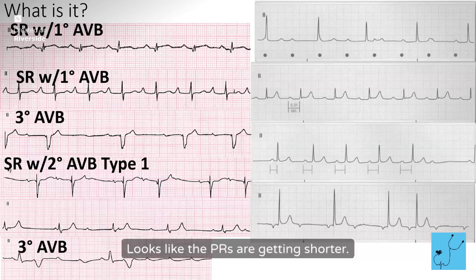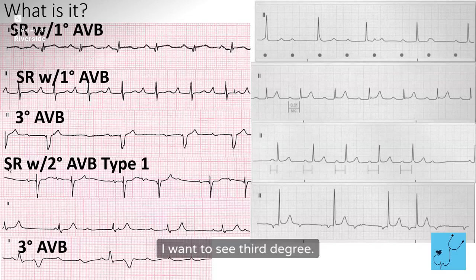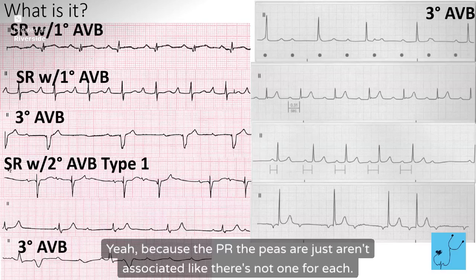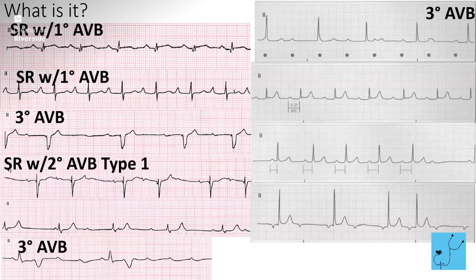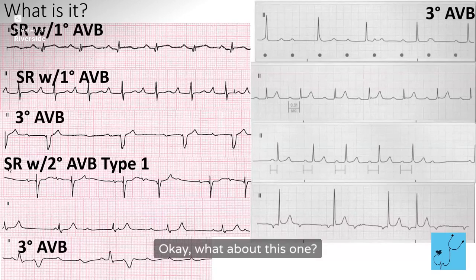Looks like the PRs are getting shorter. I want to say it's 3rd degree. Yep, you're right, because the Ps aren't associated, like there's not one for each. Yeah, there's more Ps than there should be, right? Okay, what about this one?